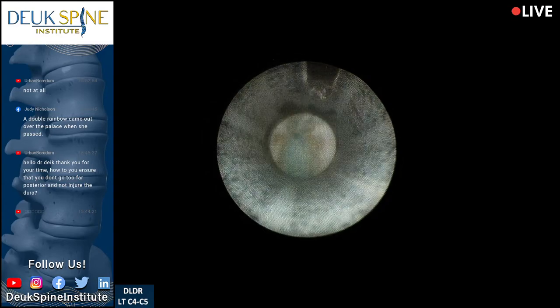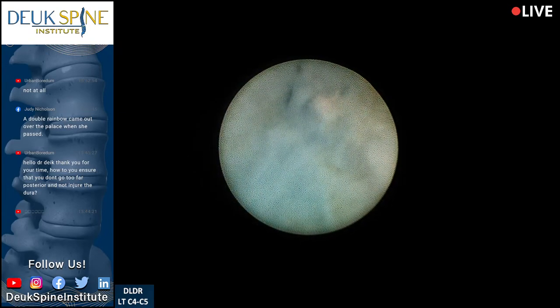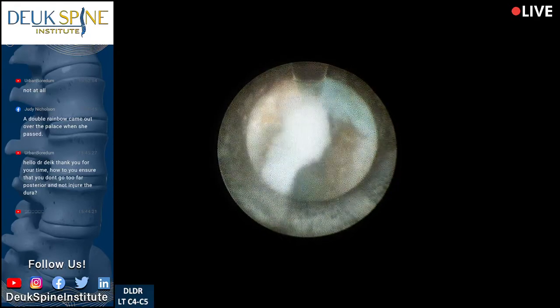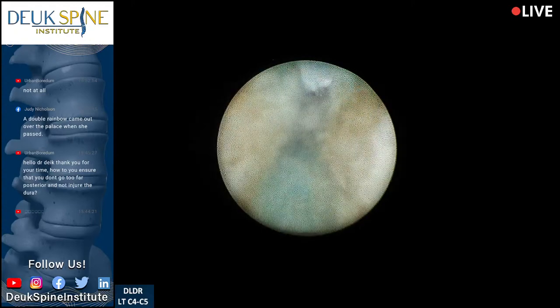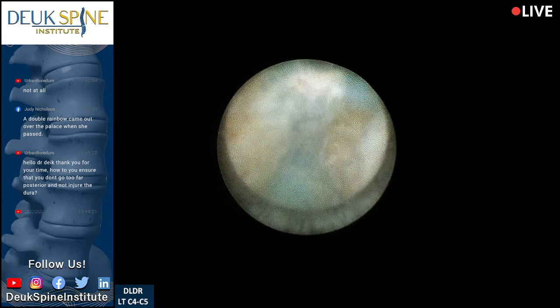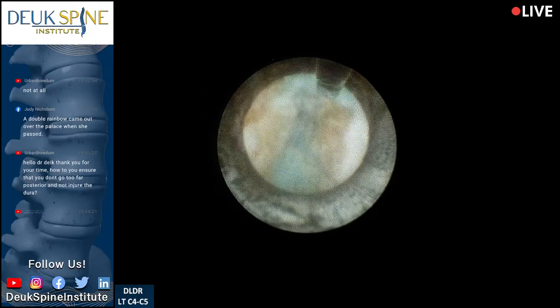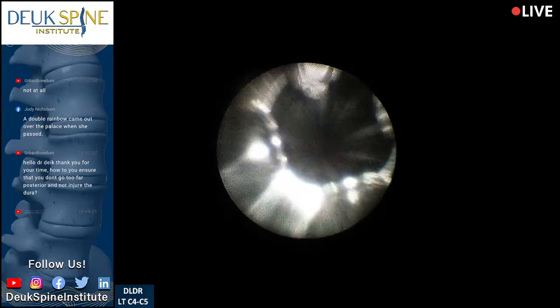Neurosurgeons are trained to be very careful — we work within millimeter and half-millimeter spaces easily. That glass fiber right there is half a millimeter. I'm actually taking away — there's a herniation that just came out of the foramen. My instinct told me we weren't done. That was the pulse wave of the laser shooting and pushing that thing out. There's no luck involved; this is not a get-lucky surgery — this is a very precise and calculated procedure. Another herniation just came out.